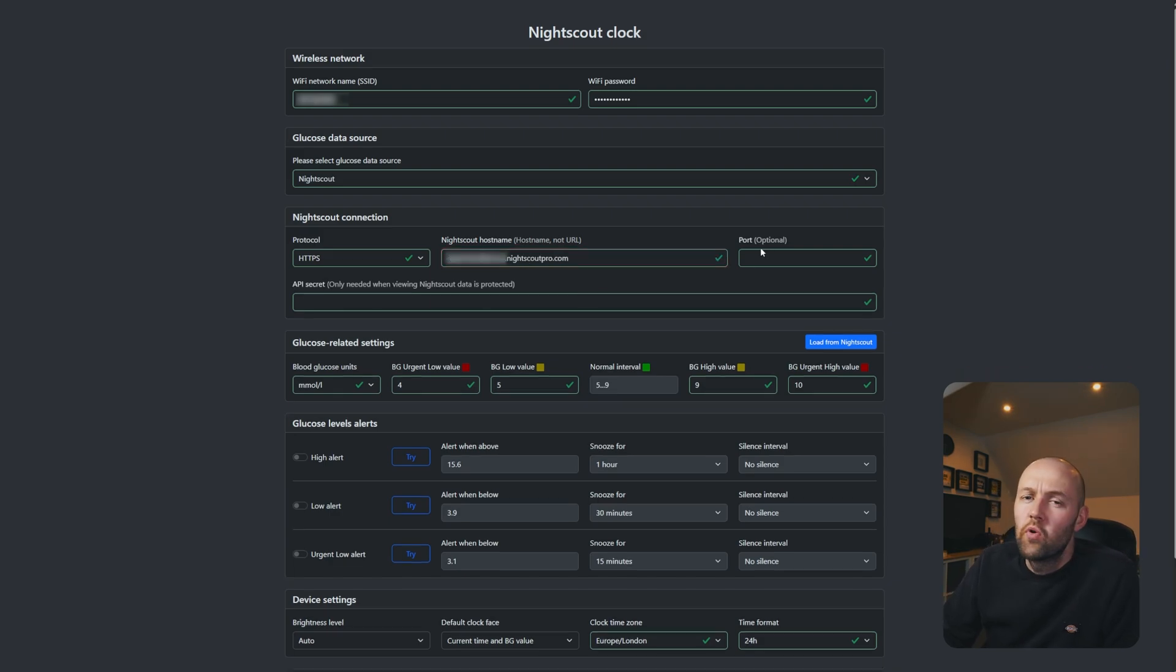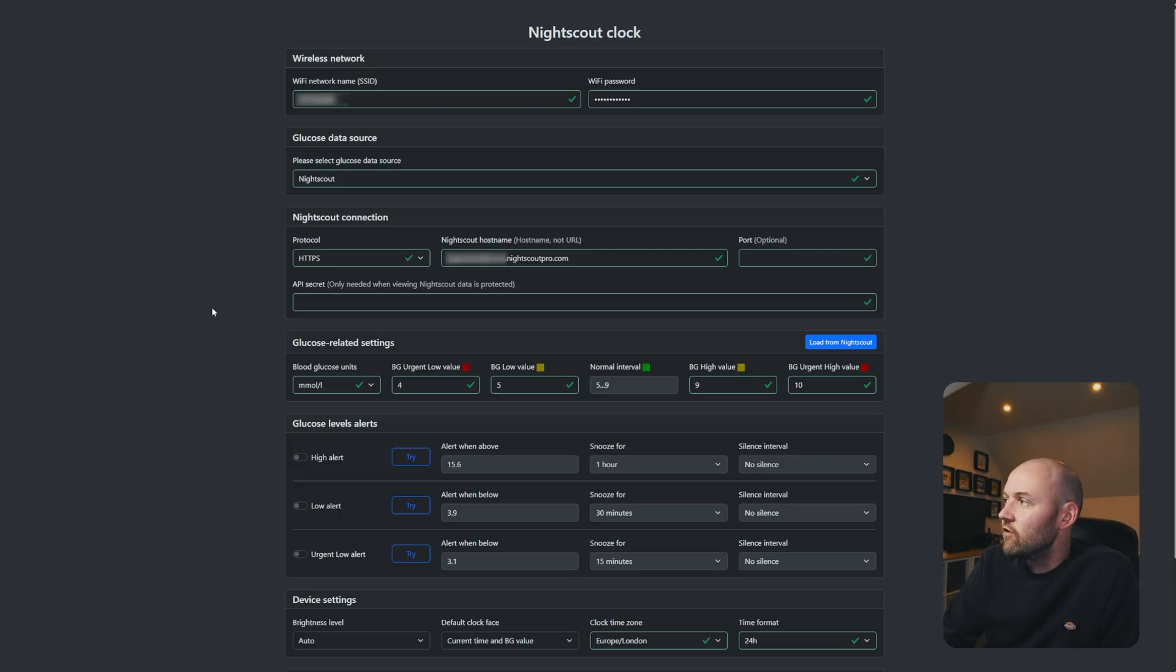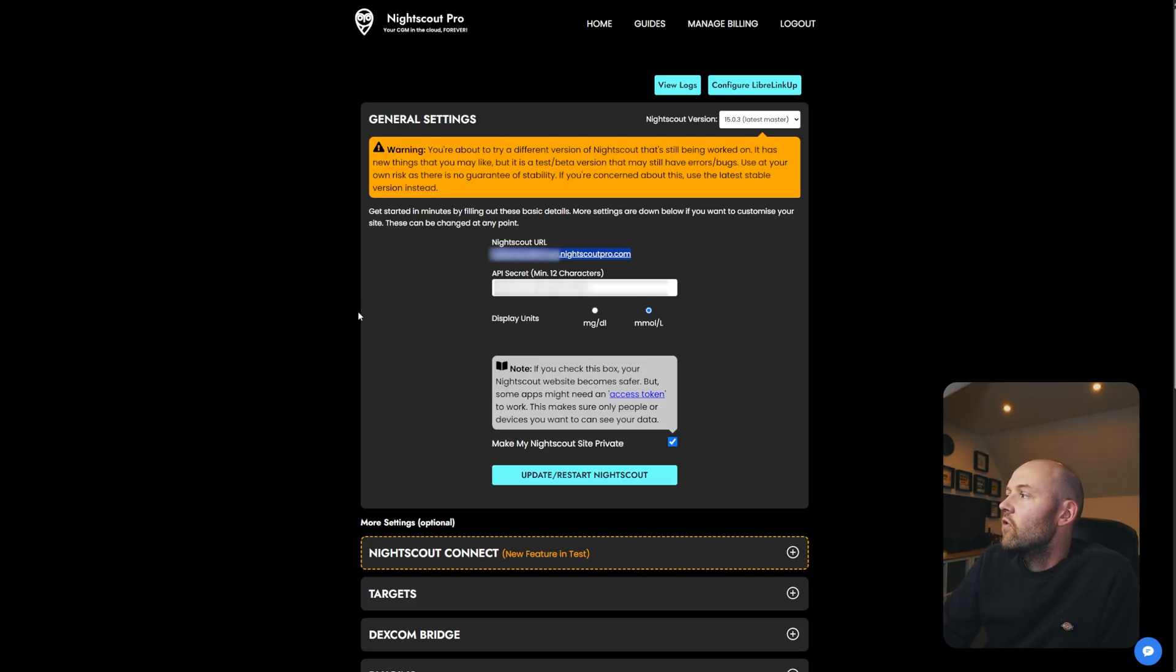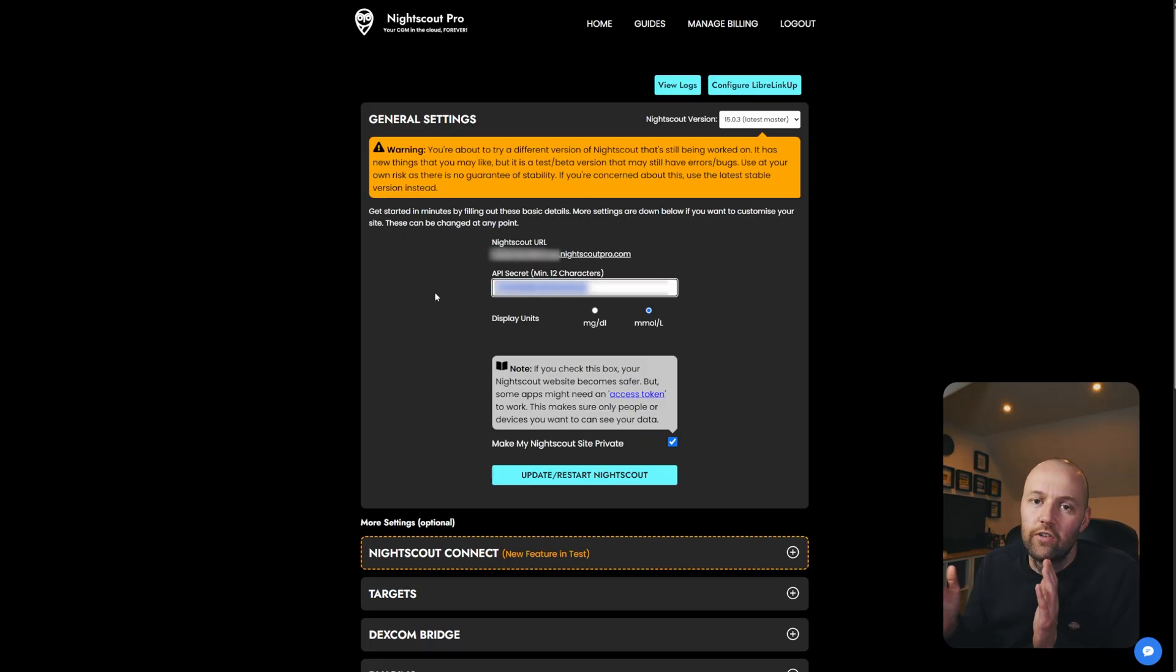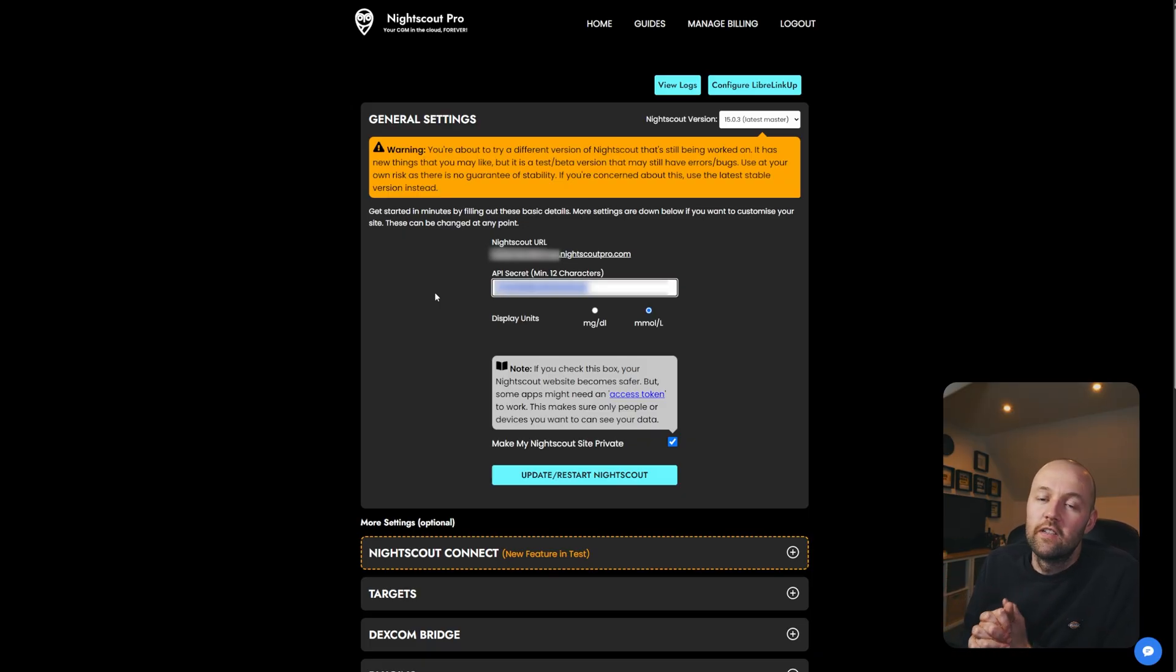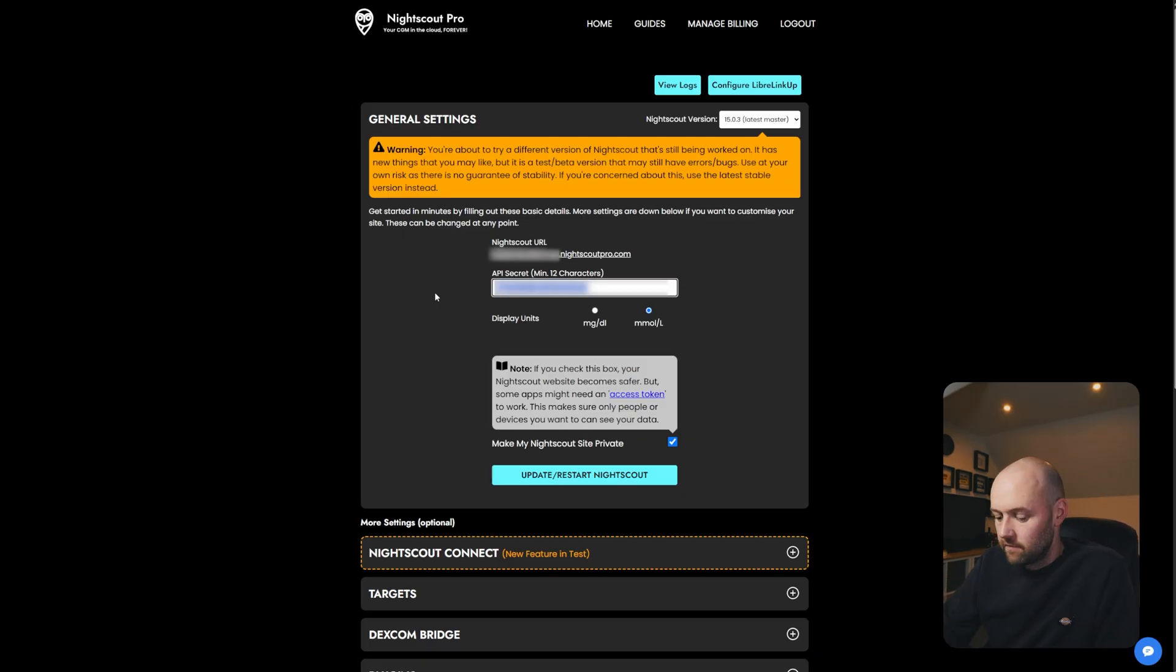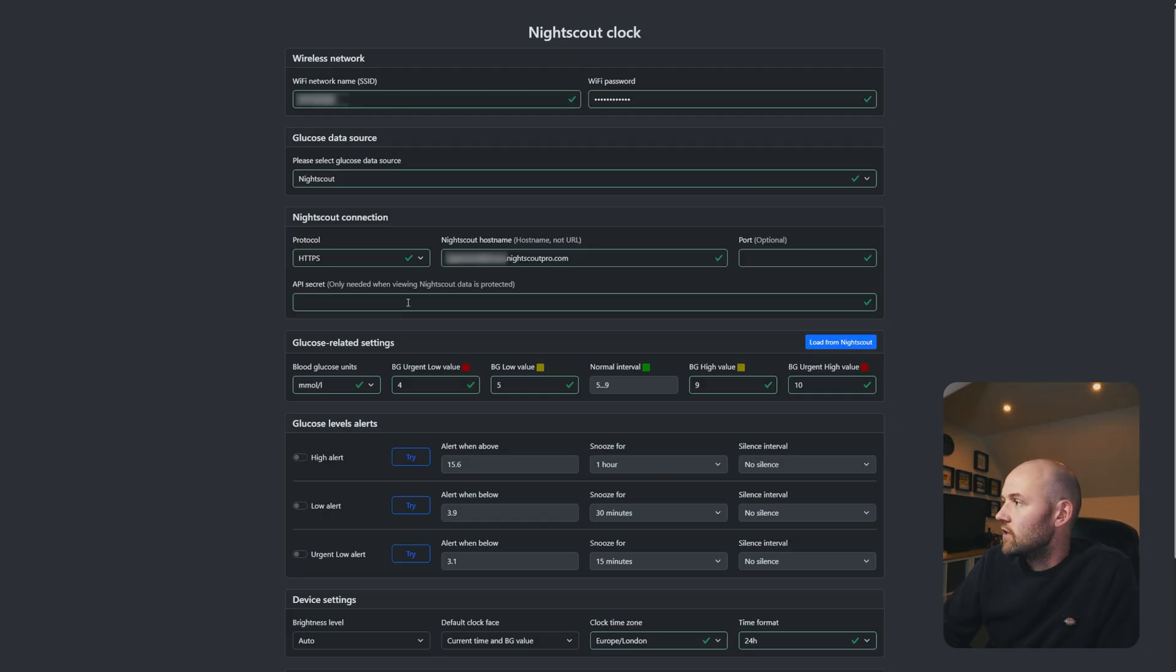I'm going to leave the port empty. We don't need that. The next part is going to be the API secret. If you've already set it up then it'll be in this box here. If not, you have to set it up yourself. The only limitation is that it has to be 12 characters in length. Obviously the longer it is possibly the more secure it is. So I'm just going to copy this and go back to the original page and put it in the API secret here.